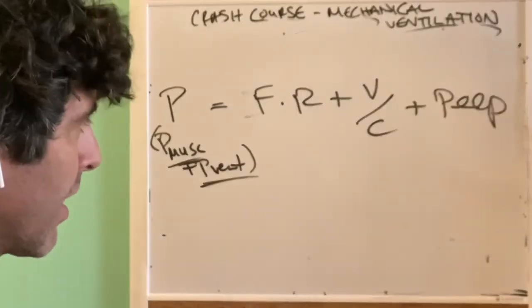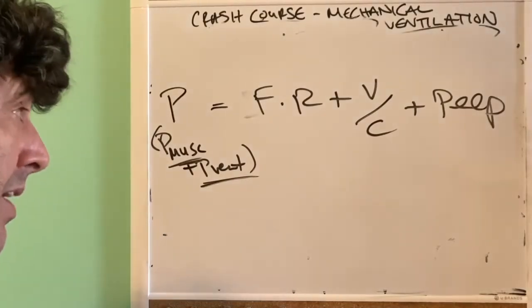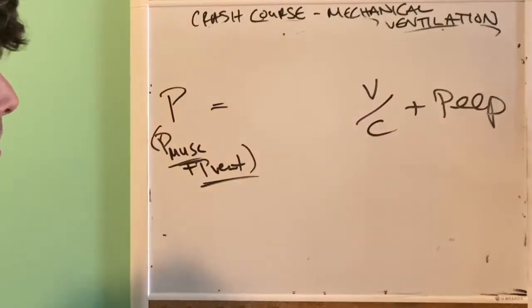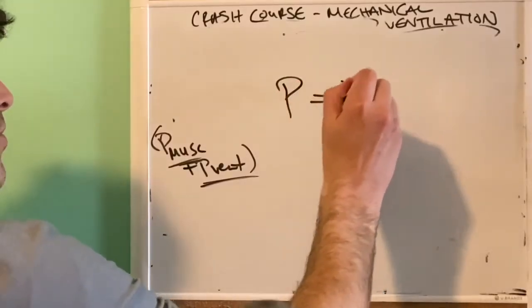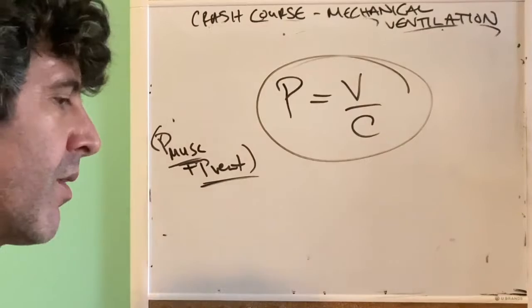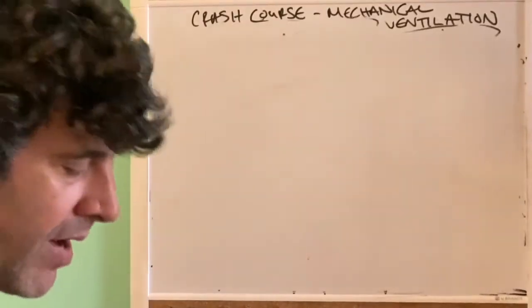Again, when you're dealing with static compliance, when you're trying to figure out the driving pressure, you're trying to figure out lung mechanics, we typically say static compliance, which is compliance at the state of no flow. So to make this easier, even if you just remember this vital relationship that pressure equals volume over compliance, this will help you to understand what's going on with your lungs on the vent, all right? All right, back to patient-ventilator interaction, all right?